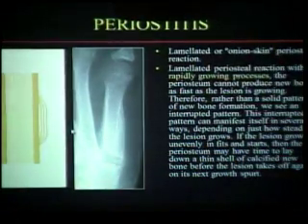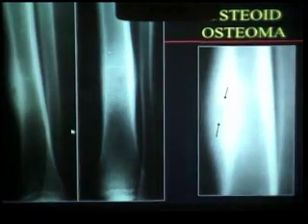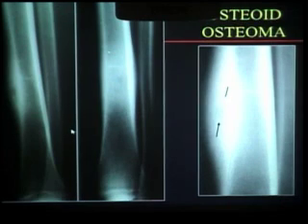Dr. Chagas: Patients generally improve with aspirin, but I don't remember that. Yeah, that's a good clinical clue, aspirin. Correct. So you may treat these tumors with interventional radiology. You can go there and try to resect the nidus with a needle. You can try to remove it. I did it several times, and to penetrate here is almost impossible. Many of these lesions will disappear with time. So if you treat the pain, it will disappear. And then you can also do radiofrequency, okay? So I think a core question was, how do you treat this: first with painkillers and then with radiofrequency?